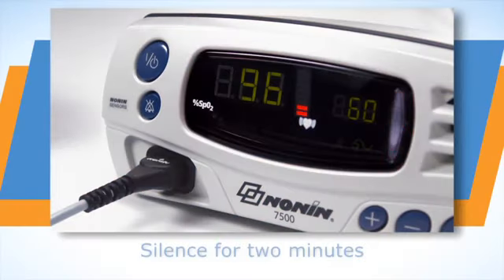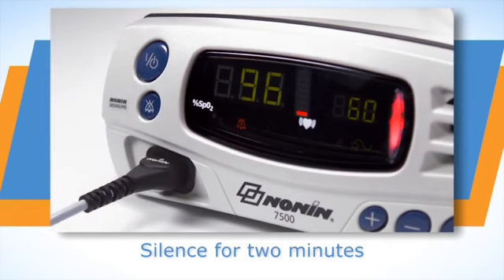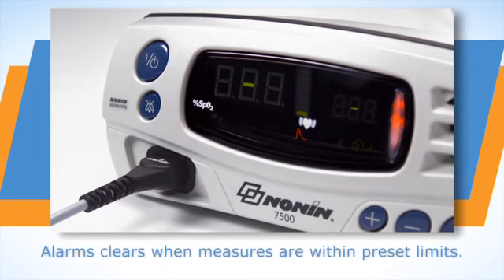You can silence the audible alarm for 2 minutes by momentarily pressing the alarm silence button. And you can return the audible alarm by momentarily pressing the alarm silence button. When oxygen level or pulse rate return to the preset range, the alarm will stop and return to normal monitoring function.